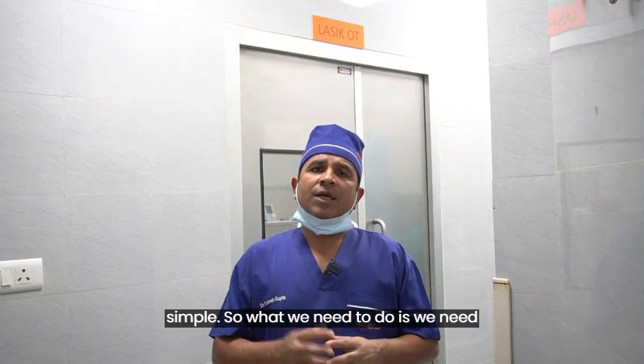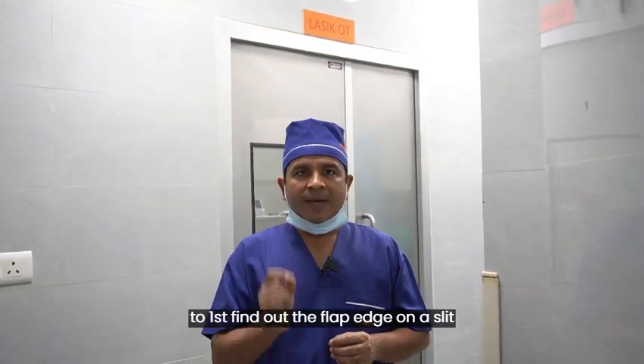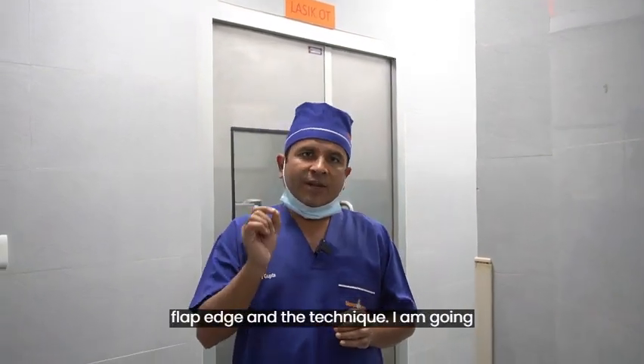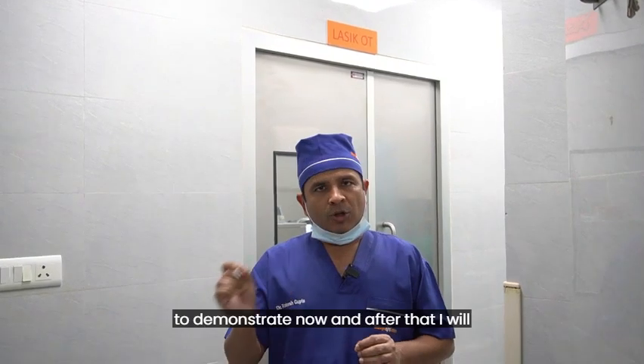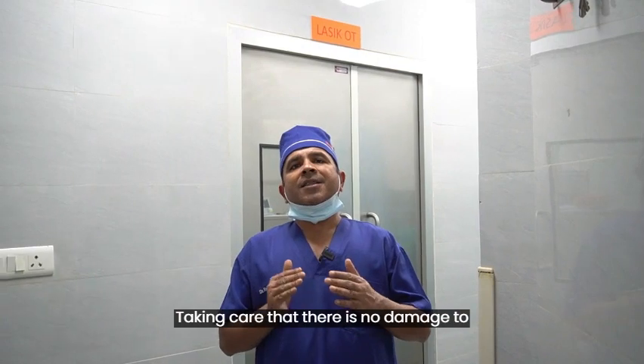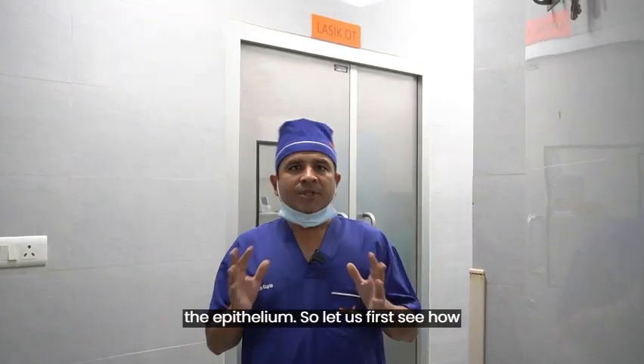What we need to do is first find out the flap edge on a slit lamp. It is not easy to find the flap under the operating microscope. So on a slit lamp we need to mark the flap edge, and that technique I am going to demonstrate now. After that I will demonstrate how to lift the flap taking care that there is no damage to the epithelium.